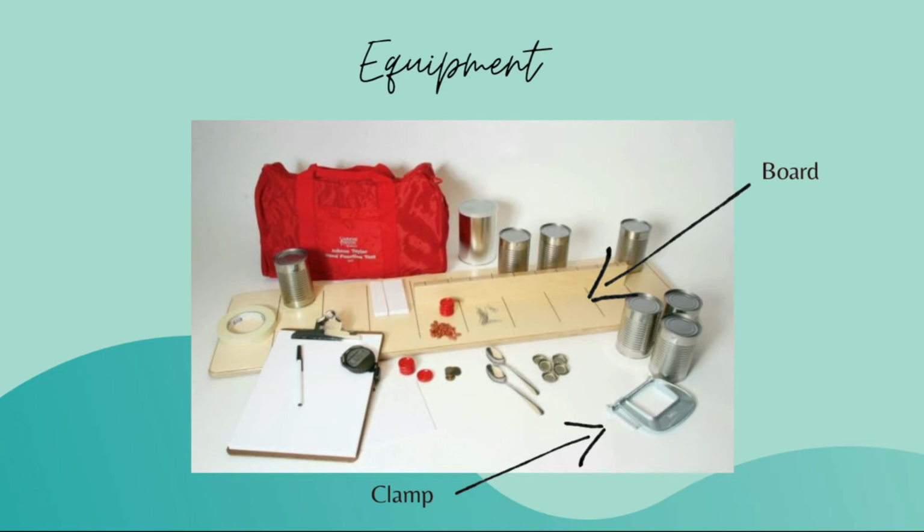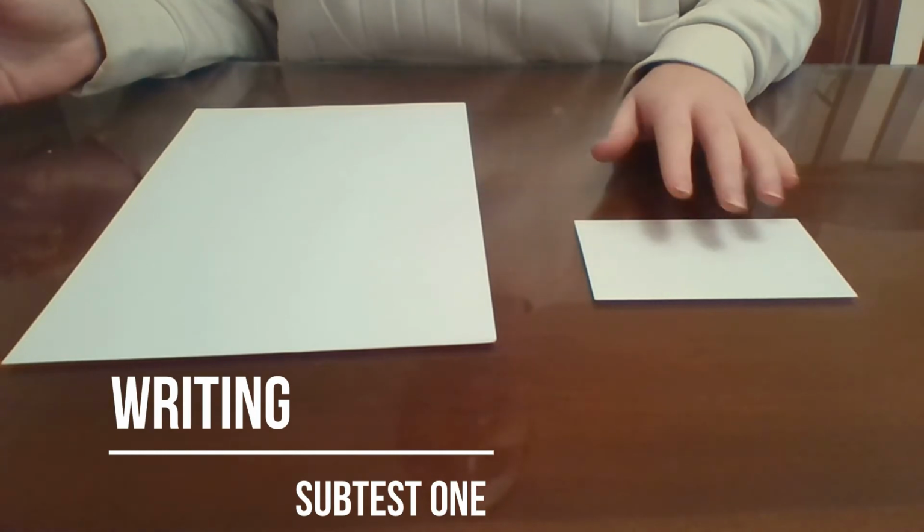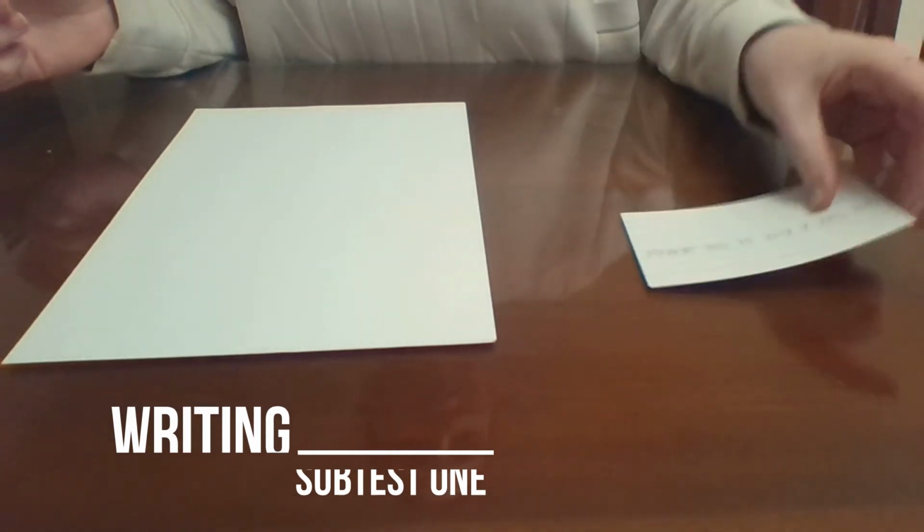Please note that these demonstrations were done using household objects to mimic the tests for the purpose of the demonstration. For this test to be reliable and valid, it should be completed with standardized equipment sent out in the test kits.